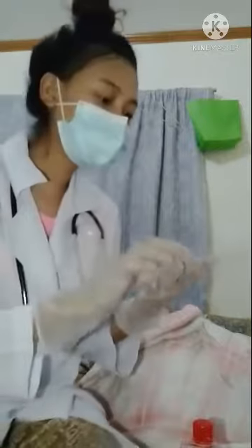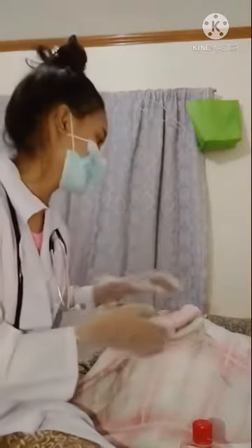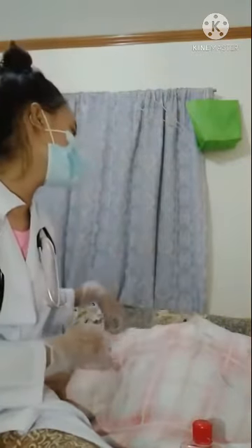And then after that, cover the patient. Help him into a comfortable position. And then after that, perform a hand hygiene. Remove the gloves and place the patient into the lowest position. And then after that, return the thermometer to the charging unit.